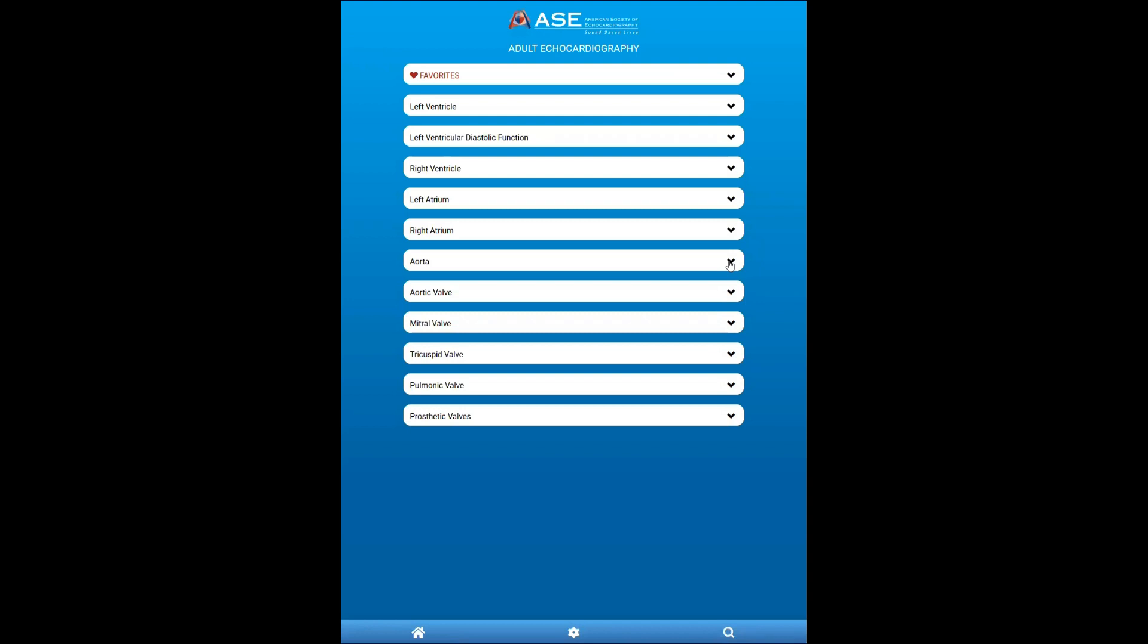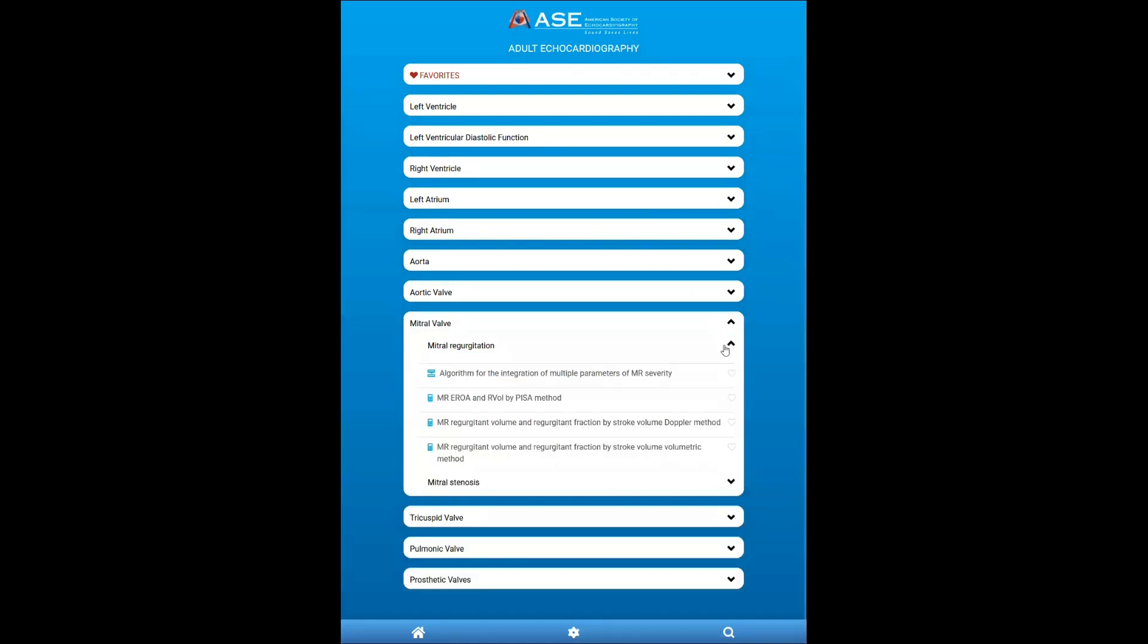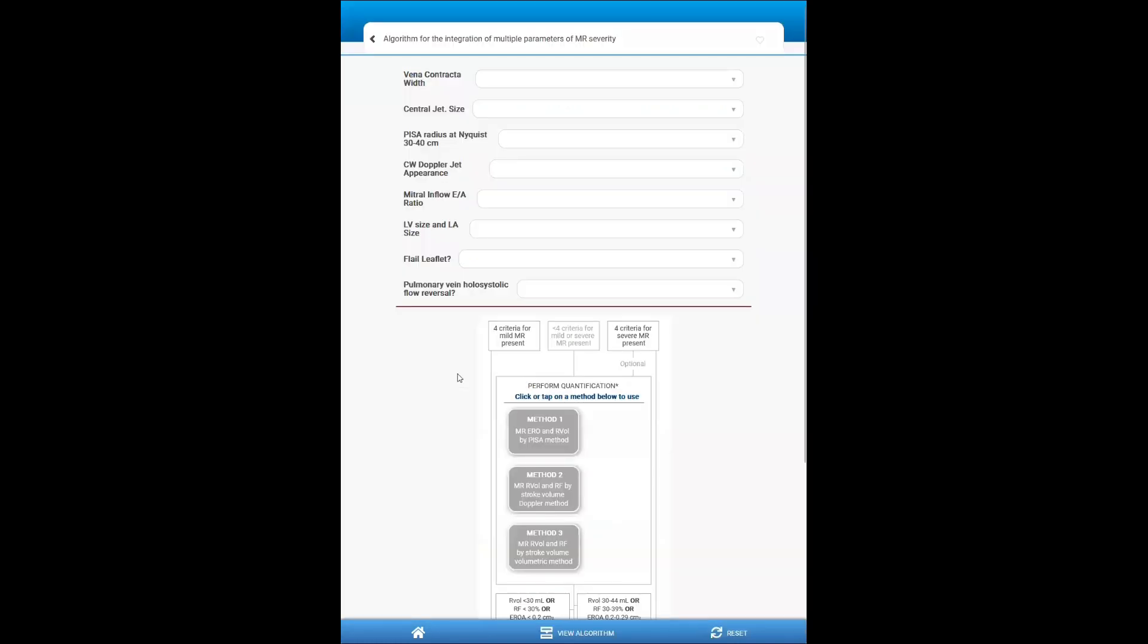And probably one of the most exciting tools are the algorithms, which can be found throughout the guidelines. So let me demonstrate one of them, mitral regurgitation, for example, and notice a different icon for an algorithm here. So the user will be asked to enter the parameters that are outlined in the multi-parametric approach for grading MR in the mitral regurgitation valve regurgitation guidelines.